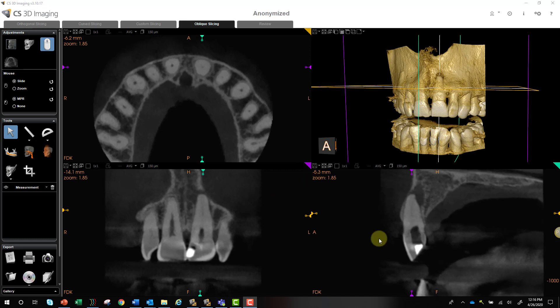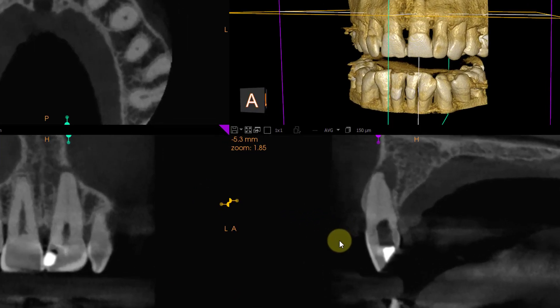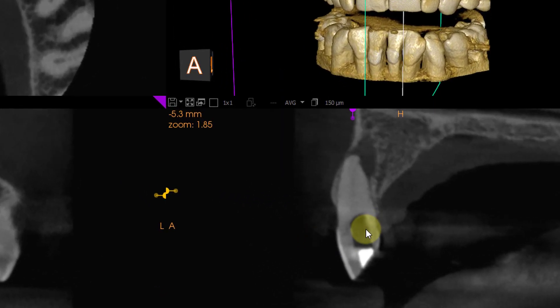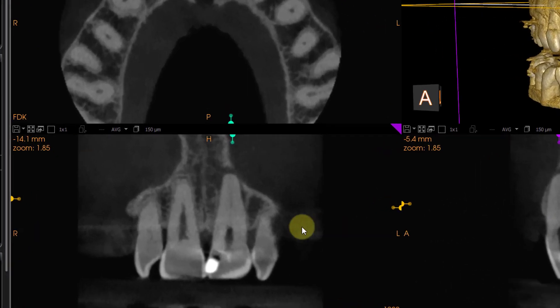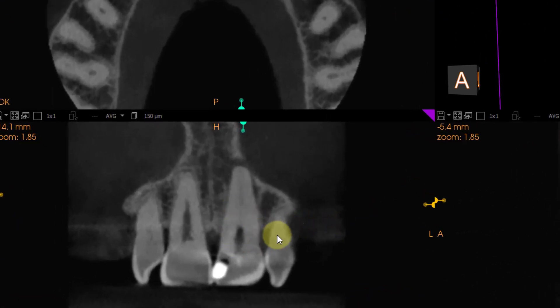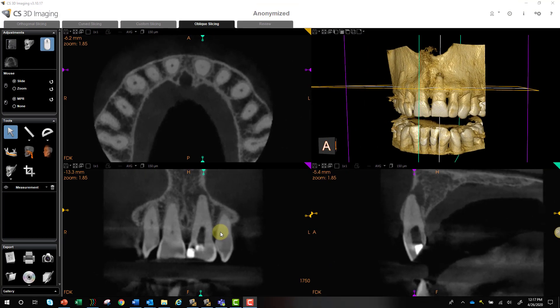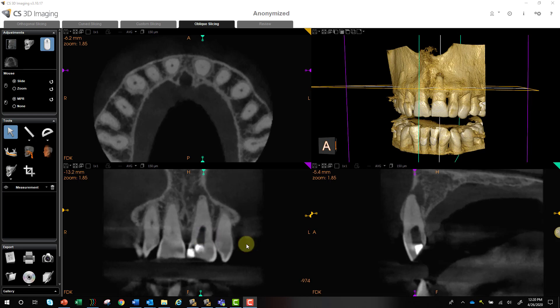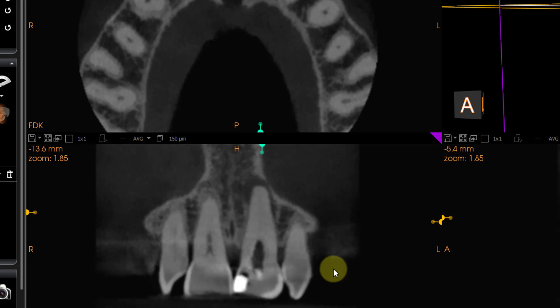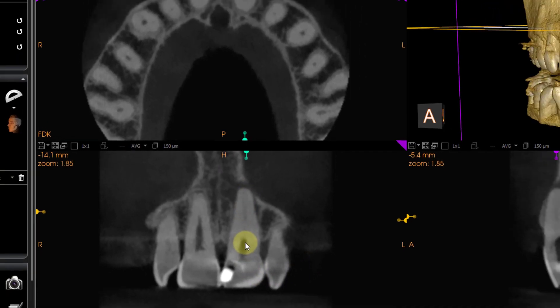So how do we use this scan to help us find the canal clinically? Well, we can see in our sagittal view — I'm just moving my mouse wheel back and forth — we can see the canal where it exits, and we can see the actual area of low density here. We can see that the GP's access was to the palate, where the actual canal was a little bit more towards the facial. We can also see in this view that the access was starting to veer off to the distal, and fortunately they stopped heading in that direction, because the actual canal was mesial to their access.